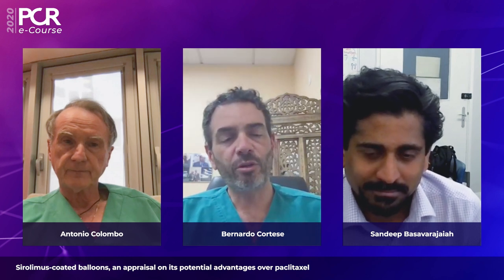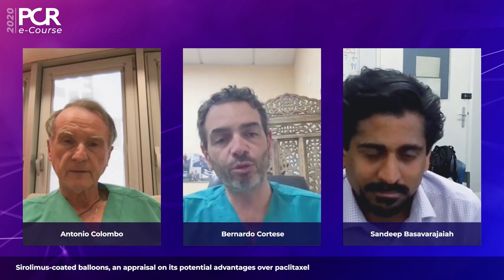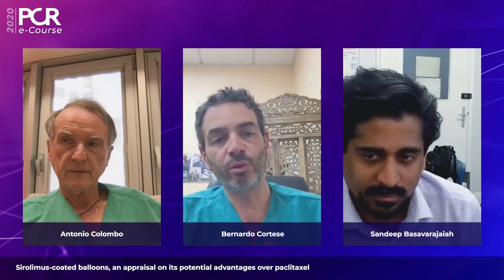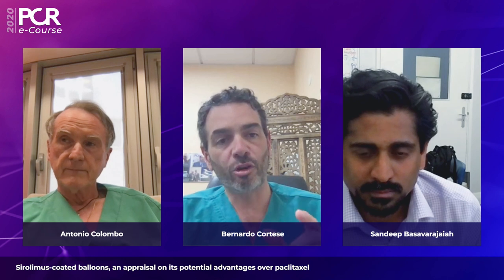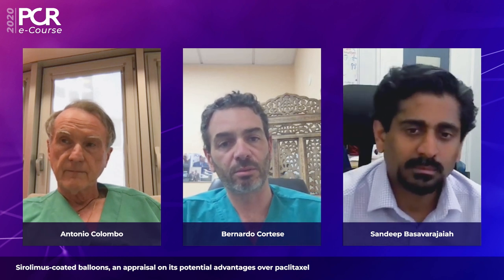And so what do you think? Do you think that the time has come to do a randomized study between a full metal jacket in multivessel disease and the short proximal stent and drug-coated balloon for the distal part of the lesions?